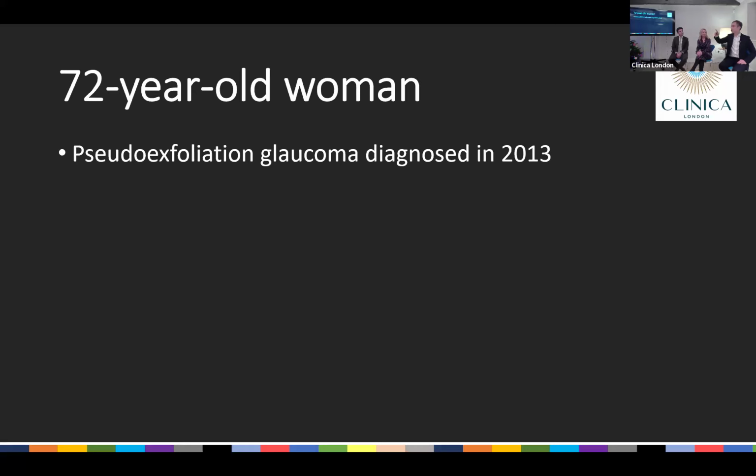Okay, perfect. And so you compare to the slope of the green line, and that was quite a bit faster than the green line, and the 95% confidence limits were even that tight on it. So sometimes, if you're unlucky and the readings are all over the place, you might not be so confident. Okay. Yeah. But you can see when you've got a great OCT and the scans have been done well, it makes those decisions quite a bit easier.